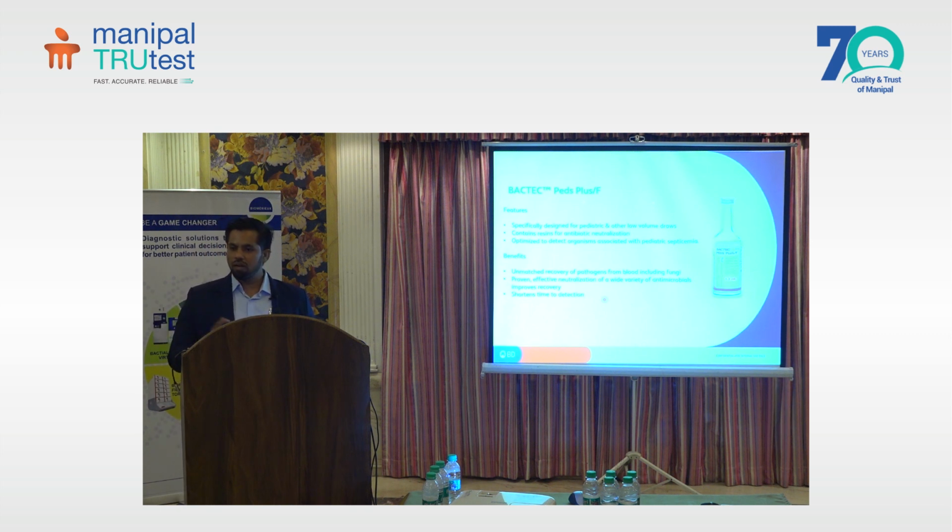And also this media can be used for sterile body fluids. As we know, the volume of sterile body fluids is also less. Sometimes we can't get 8 to 10 ml of sterile body fluids. So this media can also be used for that purpose.